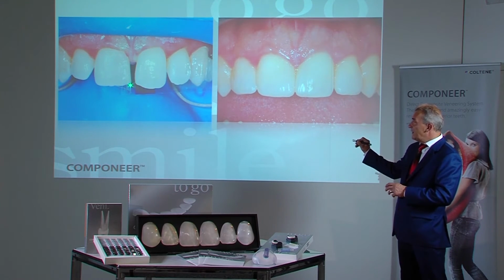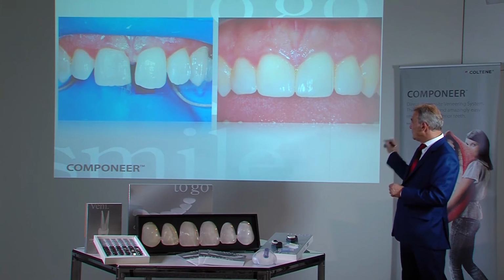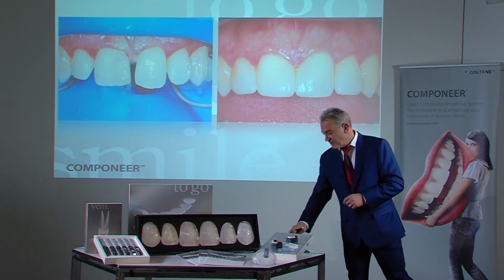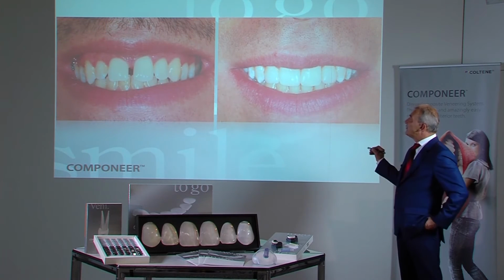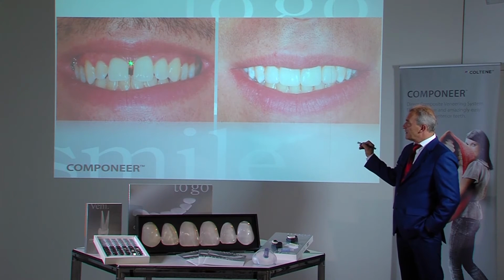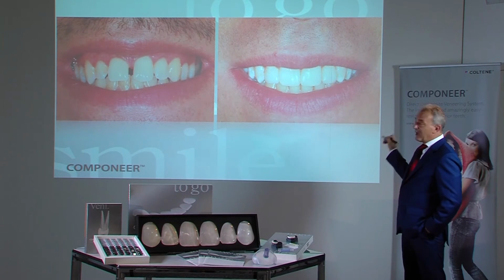First, build up towards the center was performed, followed by placing of the componeer. The proportions were largely retained. Of course, the teeth in the cervical area are somewhat wider, but this does not become obvious during normal smiles.